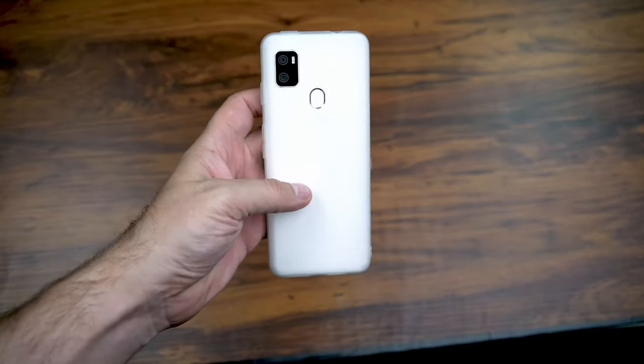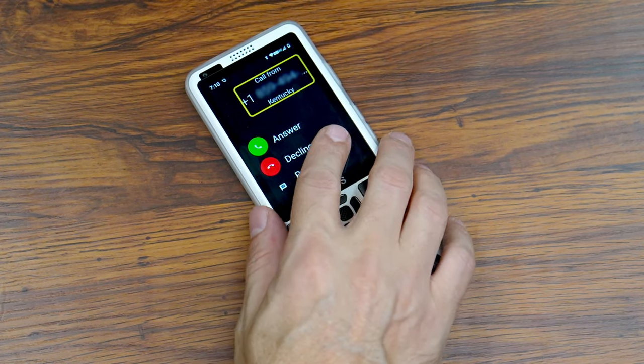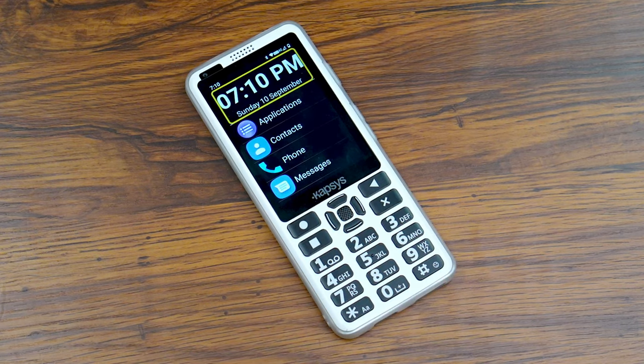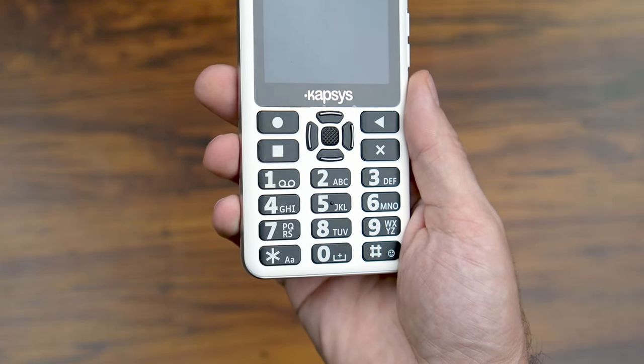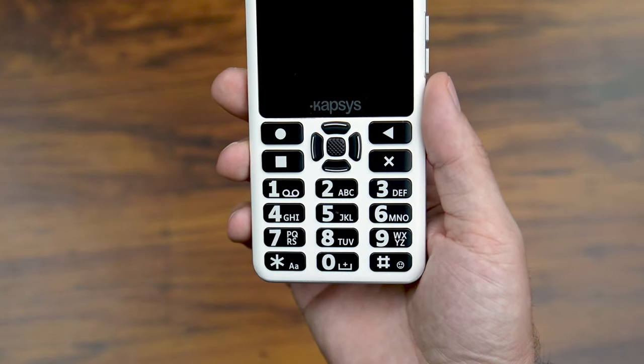Let's take a look at hardware and then we'll focus on software. The SmartVision 3 is a good looking phone, but I might just be saying that because white is my favorite color. The white and black is a very smart design choice for an accessible phone for the blind and visually impaired, because it really doesn't get much more high contrast than that, especially when it comes to the buttons. The black buttons against the white background makes them much easier to see with low vision, and they've also added a lot of tactile elements to these buttons.